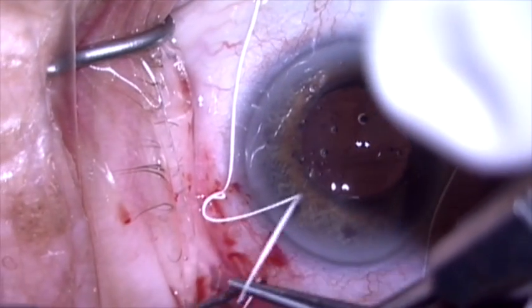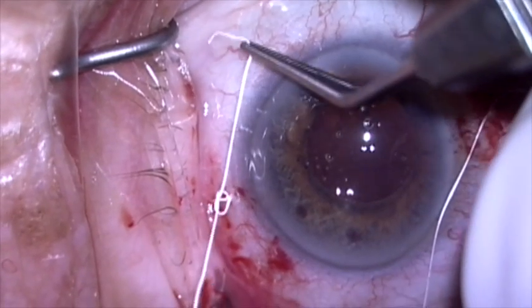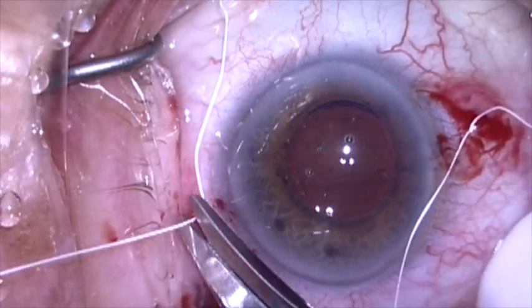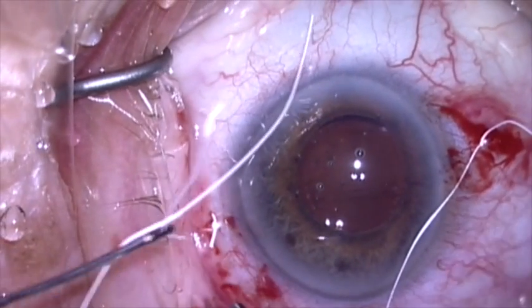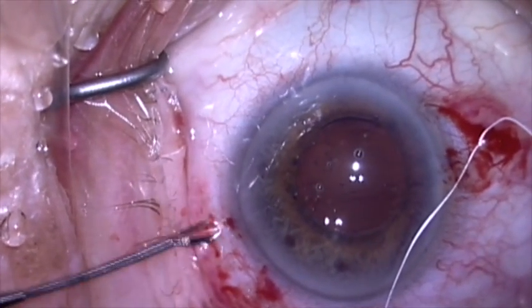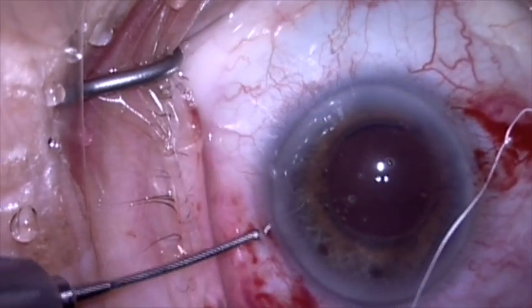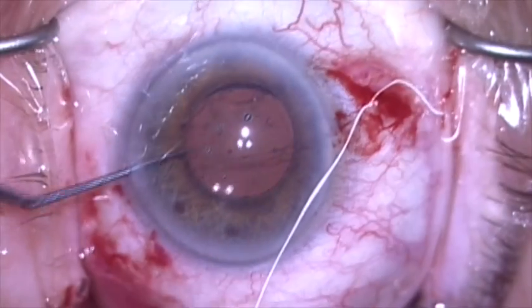I also want it just tight enough so that the suture lies at the base of the radial groove. Now I'm going to lock the suture by reversing the direction of my throws, so now the suture is locked. I can cut it and I can push the knot into the superior sclerotomy.